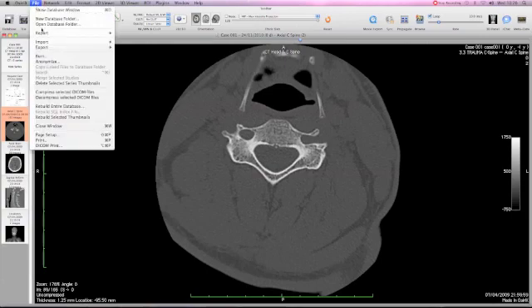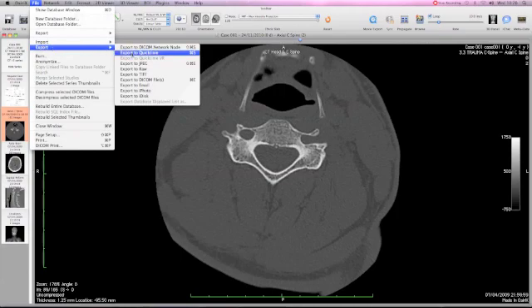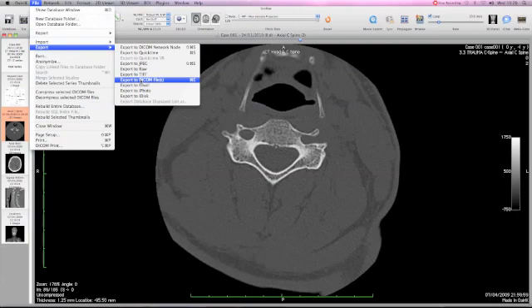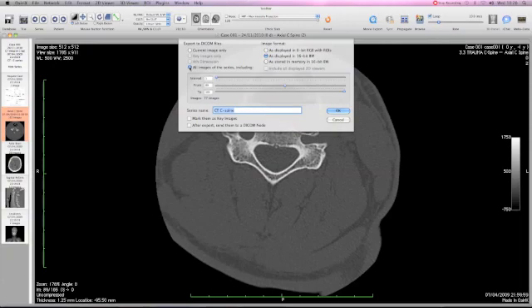We move to file, click on export function and then move down to export to DICOM because we want to maintain our images in DICOM format for maximum flexibility. This window pitches up and because we're working with a series, we want all of the images in the series to be included. And when we save them, we will save them as displayed in the 16-bit window.